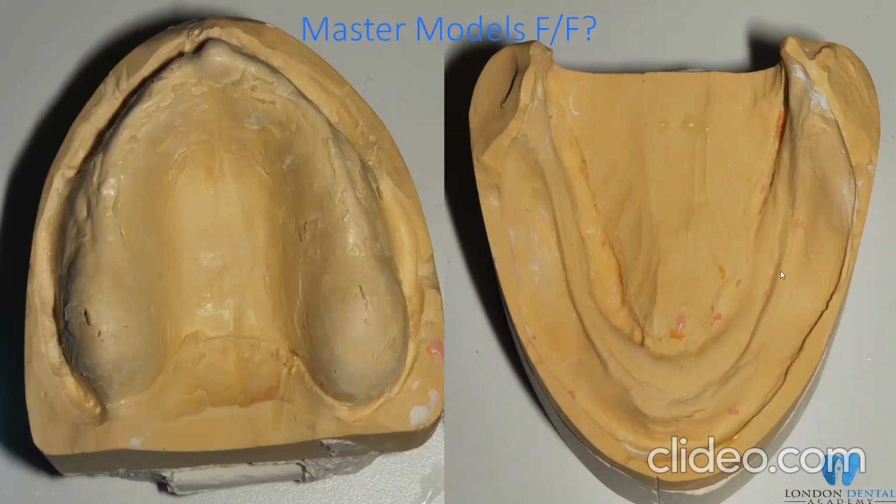And the ridge, as you can see, is not very retentive, but you have got a nice ridge, good support, and nice keratinized mucosa. When you say, well, can you see the keratinized mucosa? Yes, I can see it on the model. Can you see that ridge? Almost most of the time, if you don't have any sort of flabby tissue or some indentation, then it must be stable mucosa rather than anything else. So you need to be a little bit careful when we design our dentures or our models.